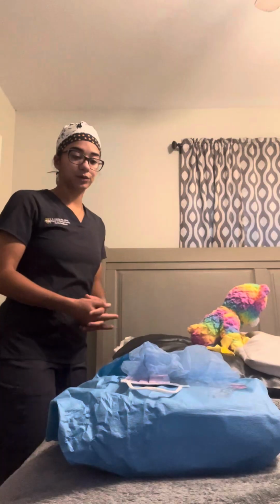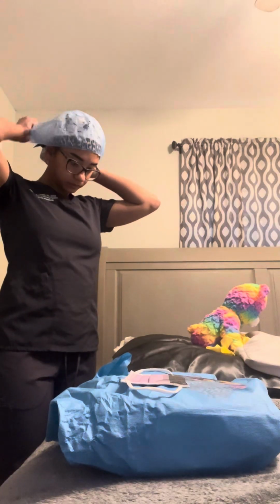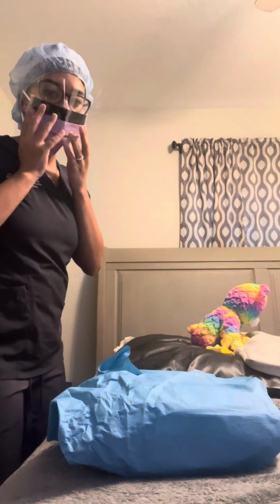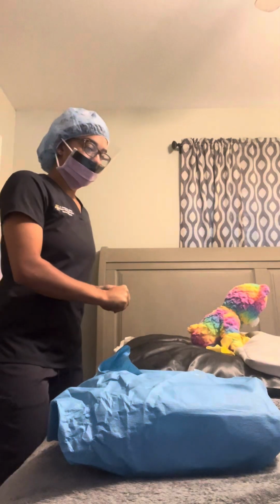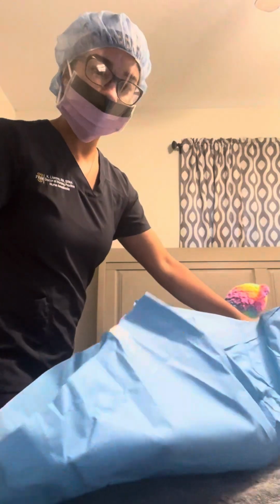After that, I'm going to don my hairnet and mask. And I'm going to wash my hands. I'm going to open up my sterile tray.